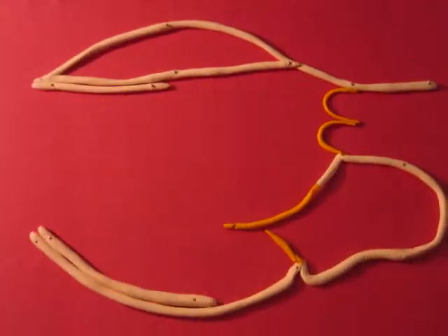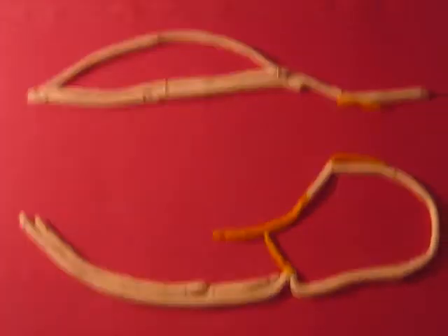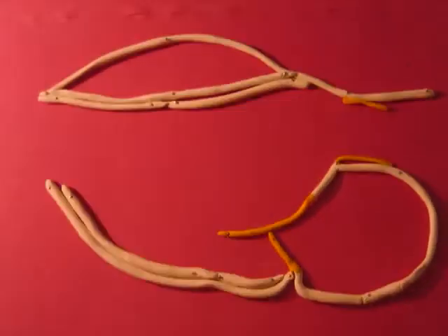There is another method of measuring the ejection fraction. It's called the Simpson's method. The Simpson's method is most accurate, but is more time-consuming.